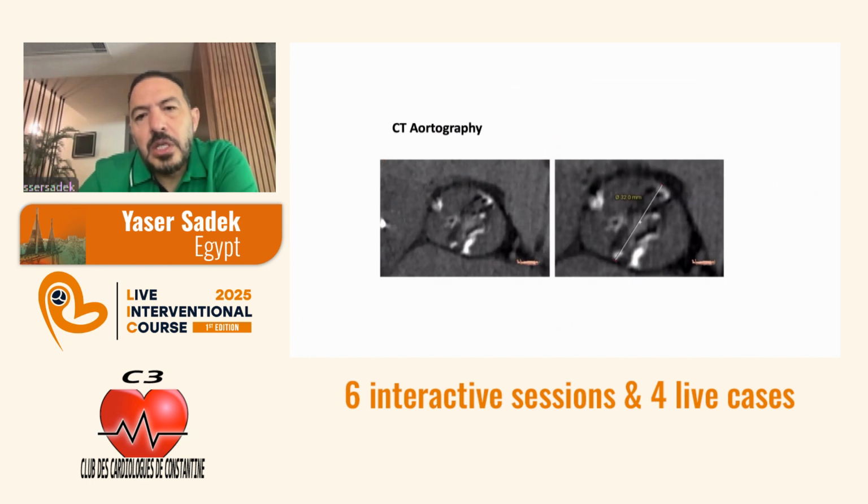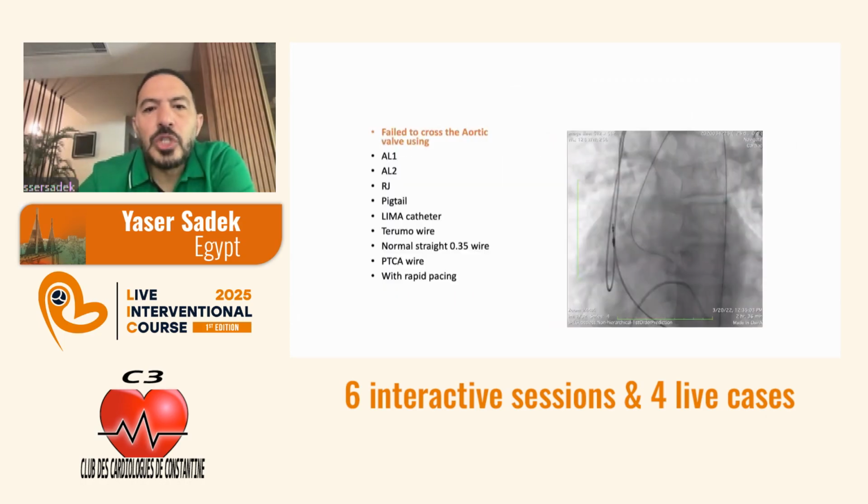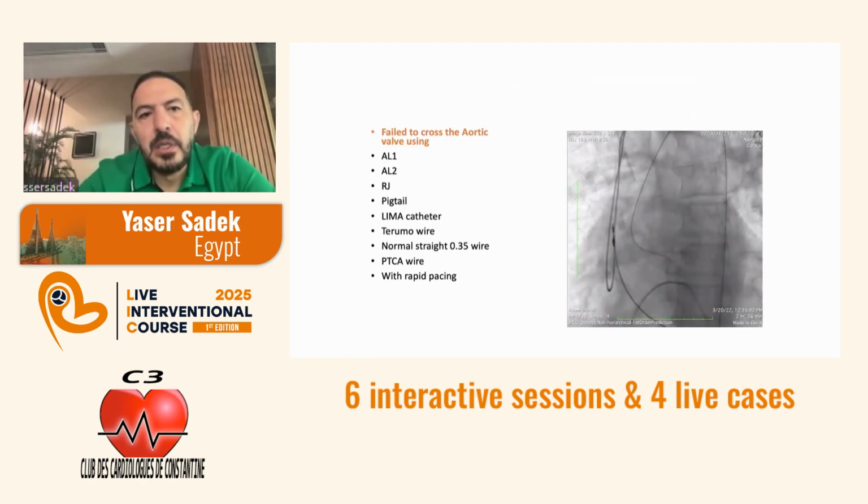And you can appreciate here, this is another type of aortic stenosis, type 0 2, and it's not clear where the leaflets are. I expected that with this patient crossing would be more challenging, but to cross this valve, it was a mess.